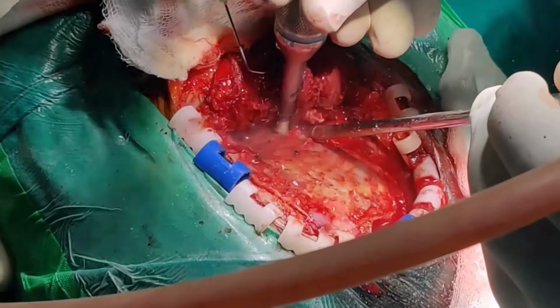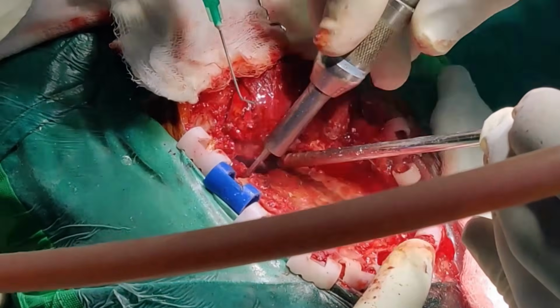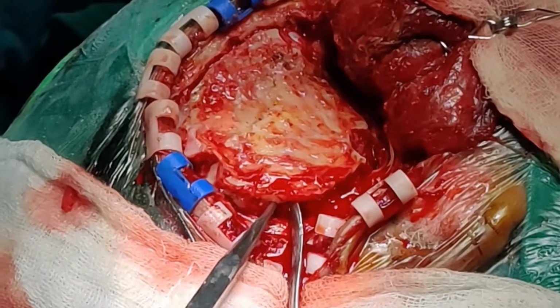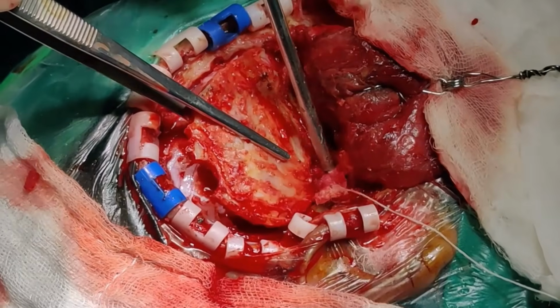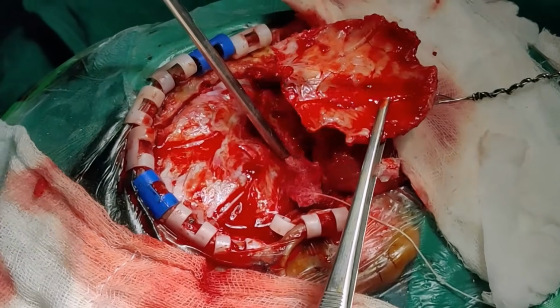These are the steps of craniotomy. We prefer to do a small temporal craniotomy with 3 burr holes, joined at the zygomatic arch. The dura mater is separated from the bone to avoid injury to the underlying sylvian fissure, temporal and frontal lobes.